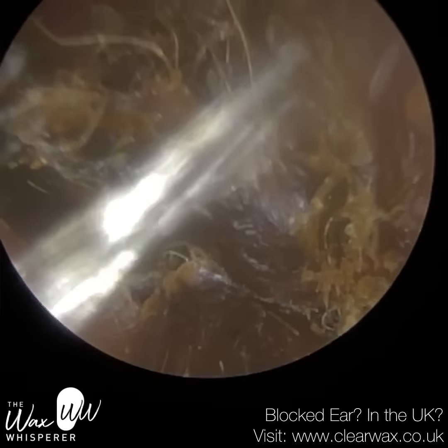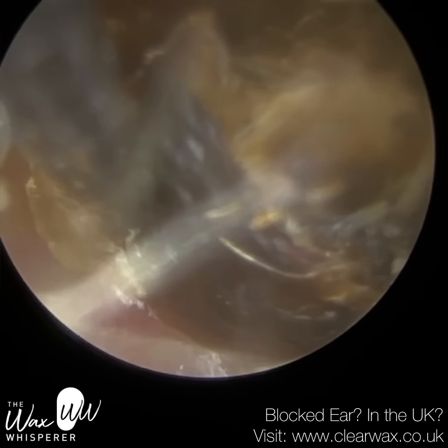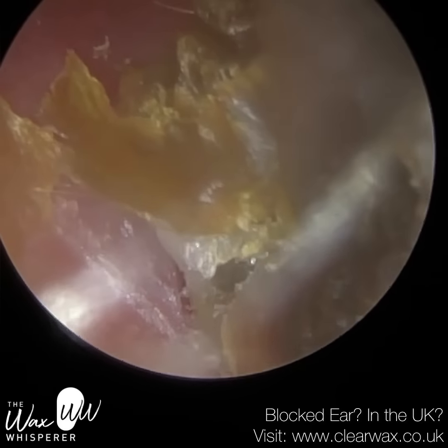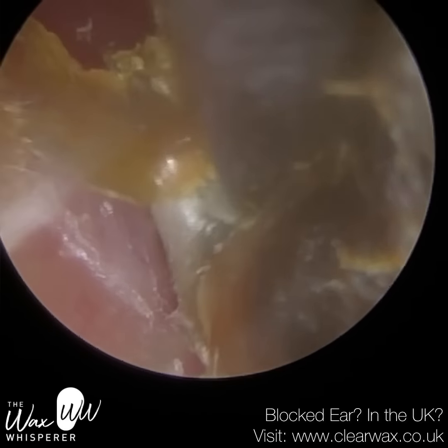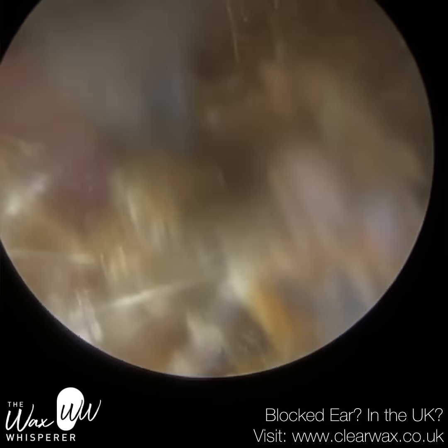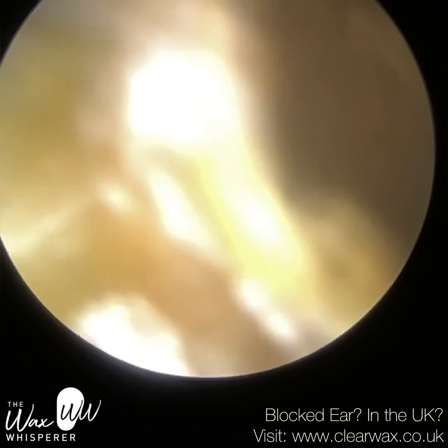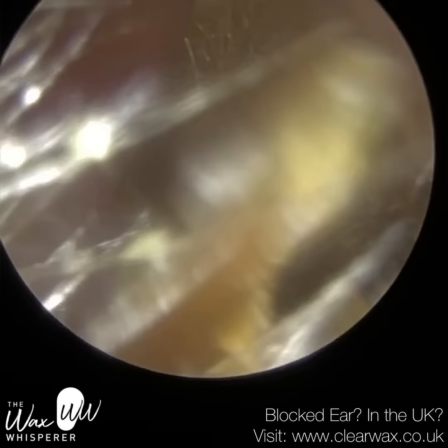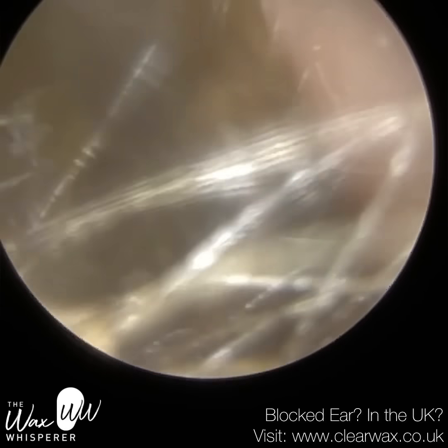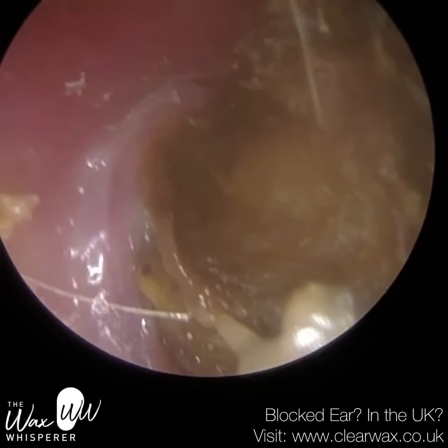And I'm not sure exactly when during the procedure, but I'm going to lift from the bottom of the ear canal some of this keratin, and you'll see some granulation tissue. So when you see granulation tissue at the junction of the cartilage and bone, where the cartilage and bone meet in the ear, which is the outer third, that's another hallmark of a grade 3 Keratosis obturans. So granulation tissue is inflammatory tissue. It's essentially a connective tissue that has its own supply of blood capillaries. So whenever you see granulation tissue, you know there's some form of healing going on, and when you've got healing, there's some form of trauma.